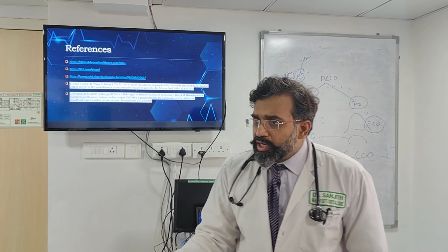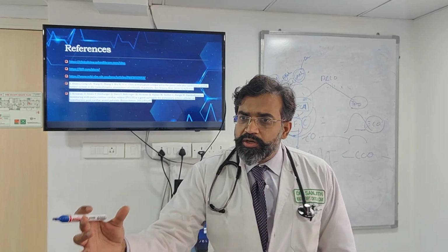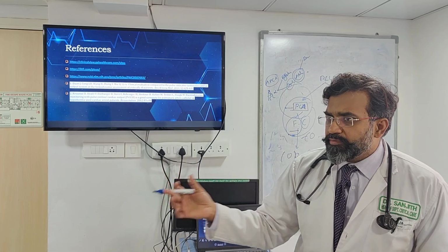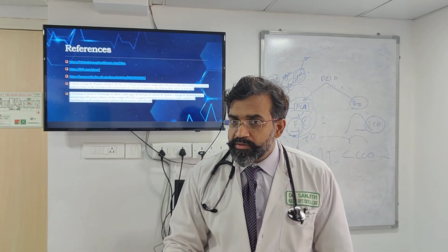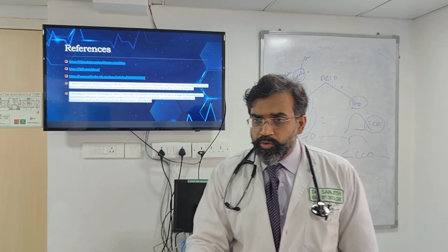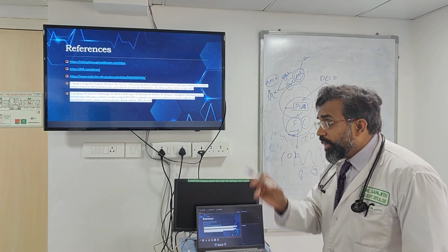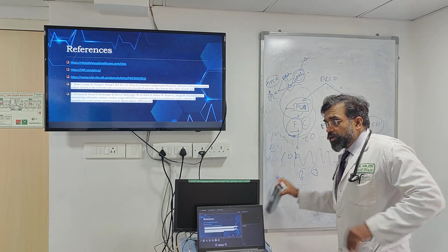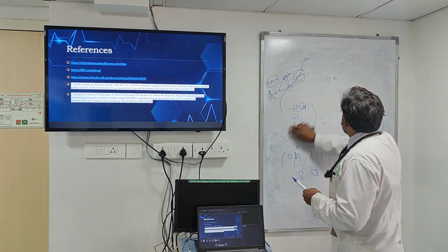And the third is when there is a big fluctuation in your cardiac output. So you have it at 2 and it has gone to 3.5. Now I need to do it. You understand? So anything that alters the compliance is what I'm going to look at. So these are the 3 ways. That is the answer to the when I'm going to do it. Right? Alright.